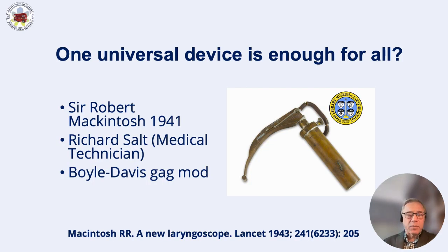Now, let's get on with our topic today. And the first question we need to ask ourselves: do we actually need to learn anything to do with awake fiber optic intubation? Do we have a tool that will address most of our problems? The tool that we've been using since 1943, when Sir Robert Macintosh invented his Macintosh blade with the help of his medical technician, Richard Salt, and the whole instrument has been inspired by the Boyle-Davis gag that he saw while he was practicing for a little while in the United States, and we still use this Boyle-Davis gag.